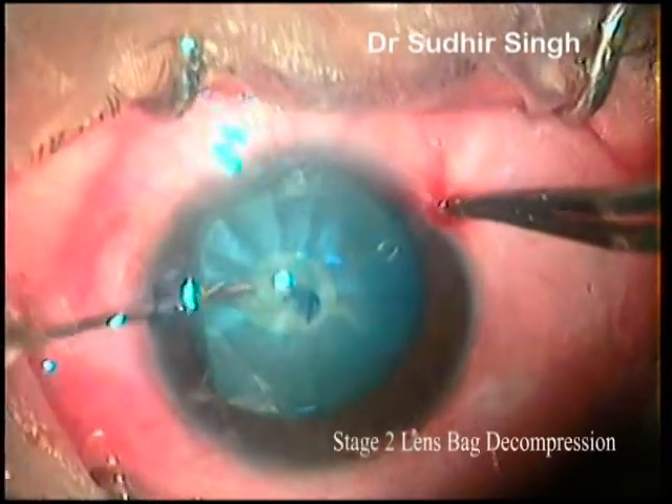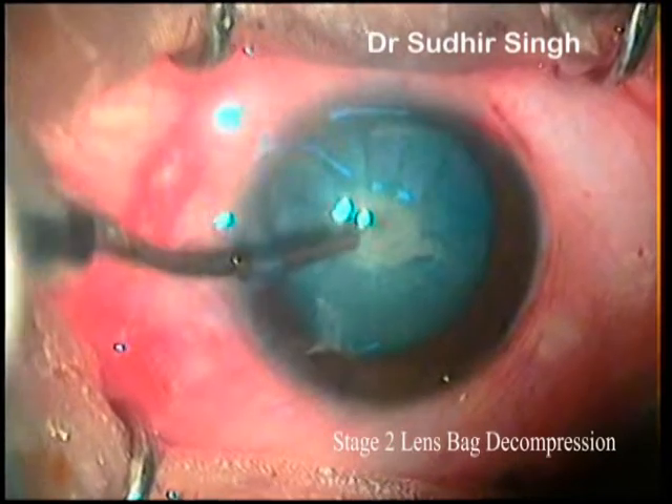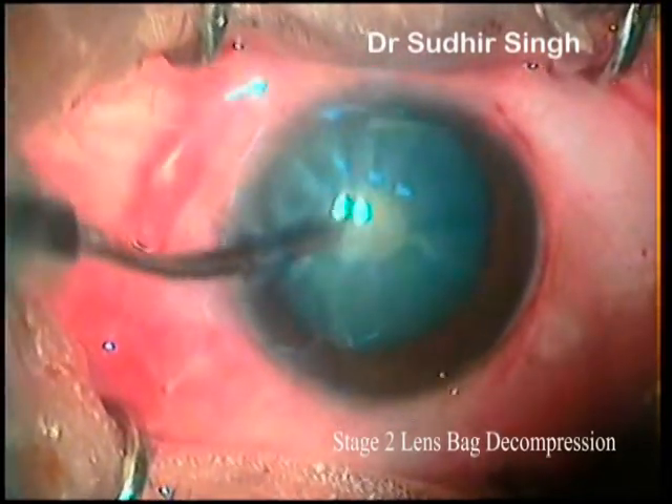Stage 2: lens bag decompression. The lens bag is decompressed by aspirating the liquefied cortical matter using an aspirating cannula.